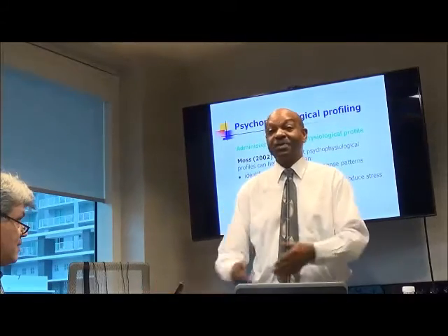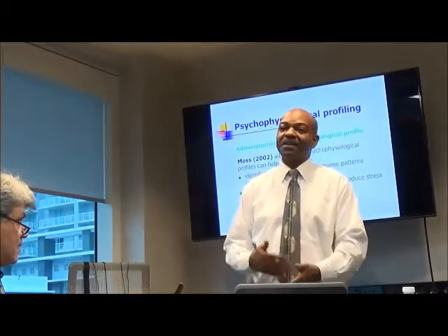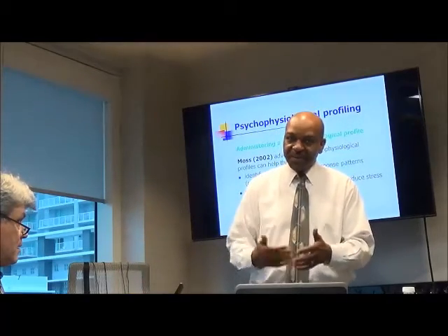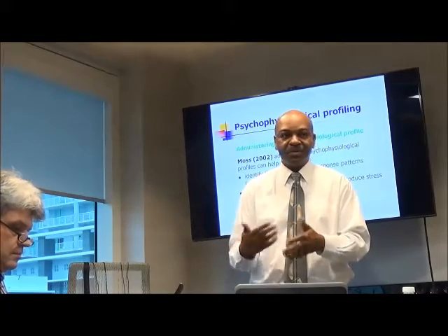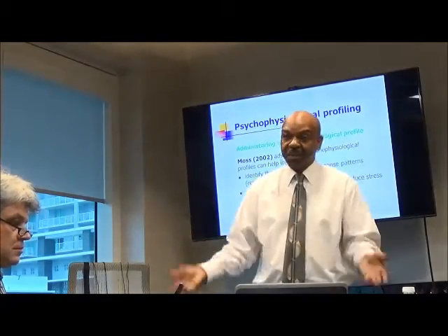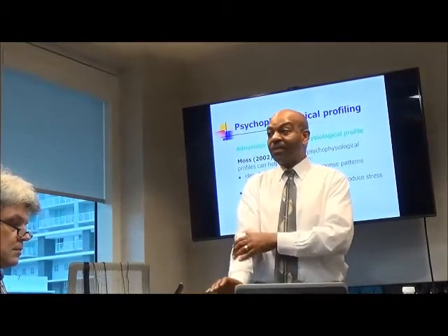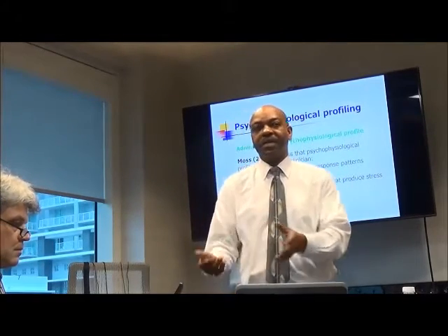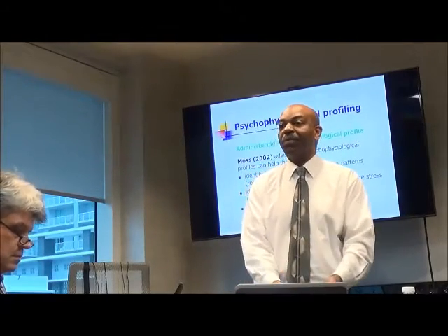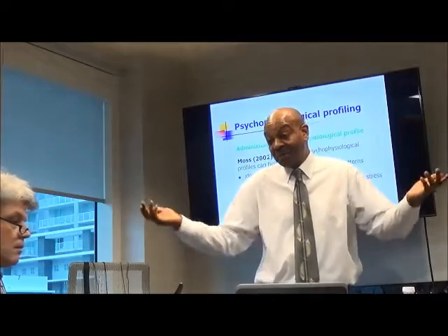Now, ideally, we should still do more sessions because maybe he hasn't really learned so that it's not going to be a problem anymore yet, and he could use more practice. But for him, he got what he needed. And basically what was happening is he was just contracting those muscles so much it was causing the pain. When he stopped doing that, even though his level was at 4 and he should be able to learn to get to 2 or 1, the symptom was gone. So he didn't care that he was only at 4, he cared that his pain was gone. So he didn't come back anymore.